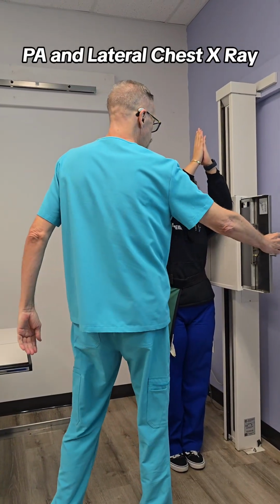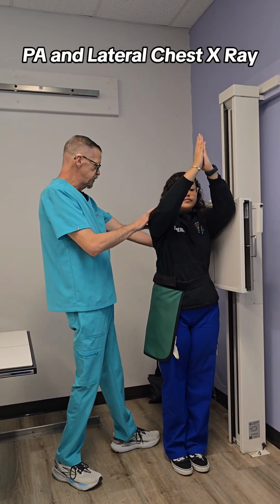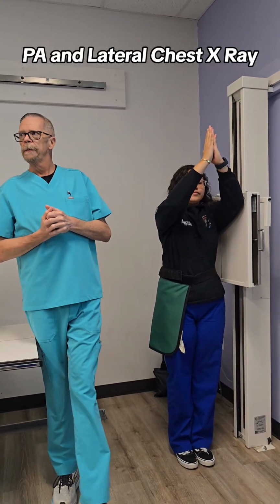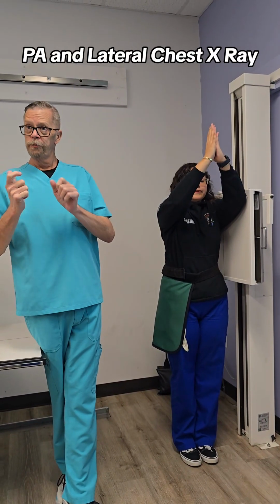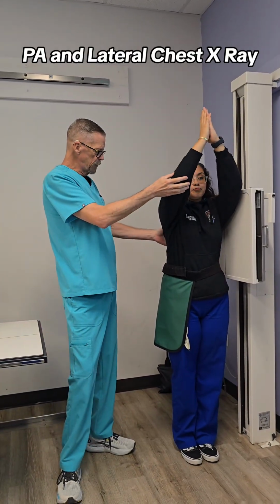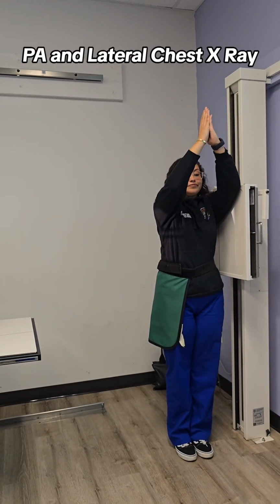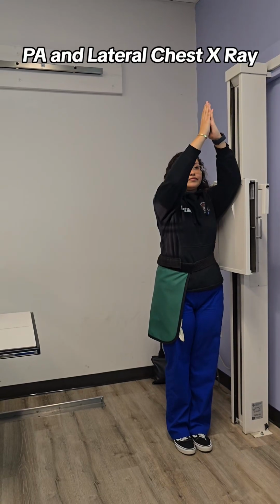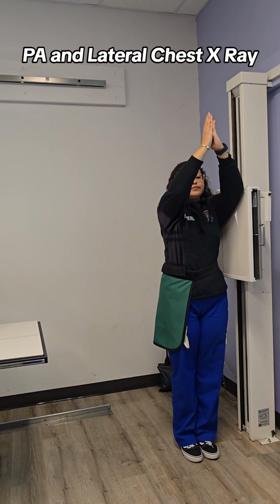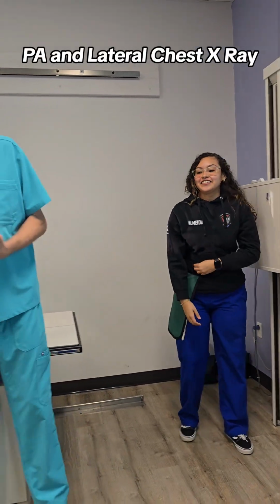Make sure I'm still lined up. Left marker is placed. Be sure that the patient is not rotated. On an x-ray, how would we tell if they were rotated? Separation of the posterior ribs, exactly. All right, bring those arms up just a little bit more. Mid-coronal plane. All right, again, have the patient take a deep breath in, let it all out. Another deep breath and hold, and you can breathe. You can relax. You can put your arms down. So that would be your PA and lateral chest x-ray.